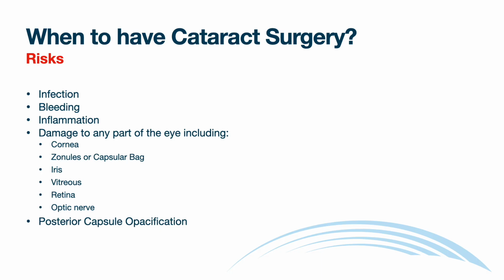However, the most common issue after cataract surgery is often dryness, and usually some level of dryness exists prior to surgery. Finally, many people ask if cataracts grow back. The answer is no, they should not grow back. However, sometimes as our bodies heal, months or maybe even decades later, we create scar tissue over that clear lens that was implanted, and this can be treated with a simple laser procedure in the future. You do not have to go back to the operating room for this.